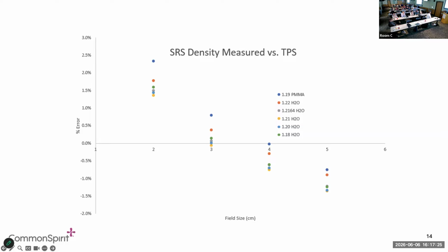So I know that when my field size increases for whatever reason due to tumor, I will have a different absolute dose output on the ArcCheck software, right? And so that's why, if you've ever noticed that difference and wondered why this is happening, it has something to do with this.